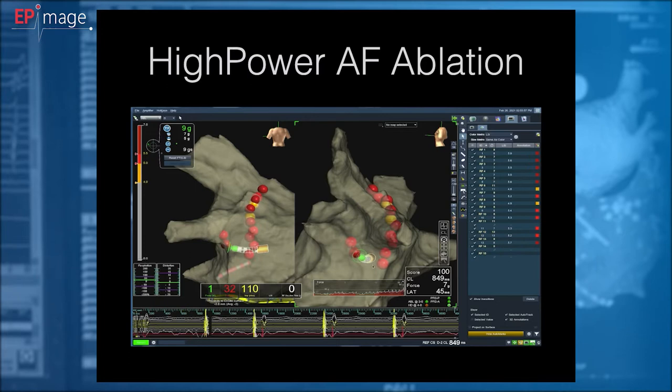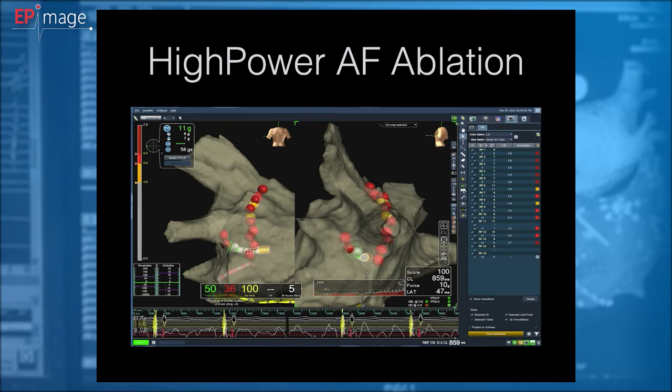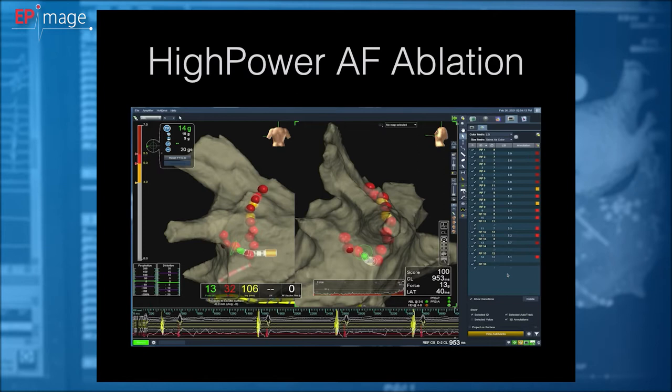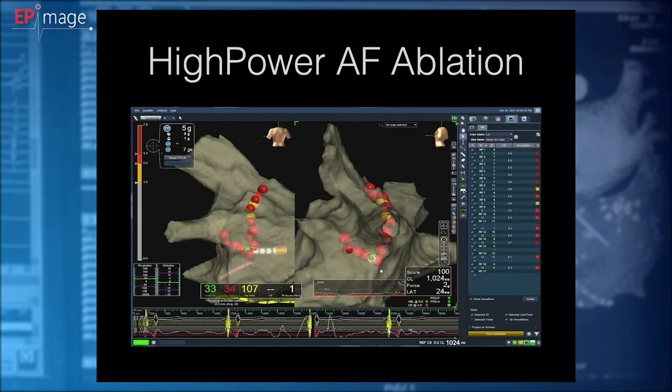And to have proof for that with esophageal probes and measuring temperature, the cooling down on posterior wall is quite prolonged. So you see I'm now closing inferior portion of left pulmonary vein, and we'll move on with our presentation.